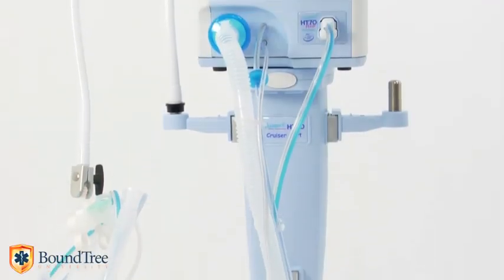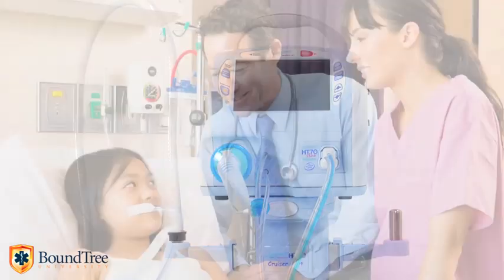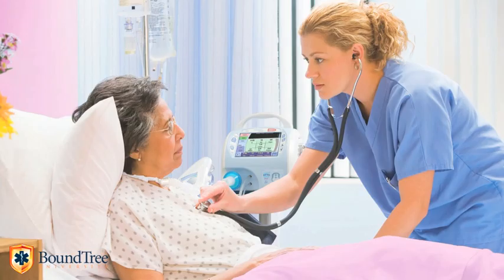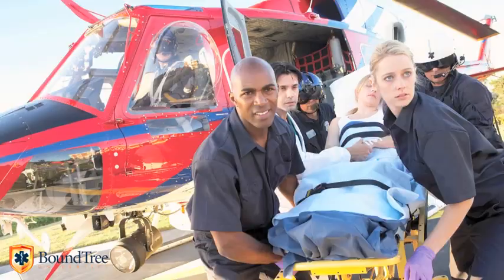The HT70 family of ventilators is intended for use on patients from 5 kg to adults in hospitals, long-term care, home care, air and ground transport, and emergency preparedness. It is also approved for use on commercial airline flights.